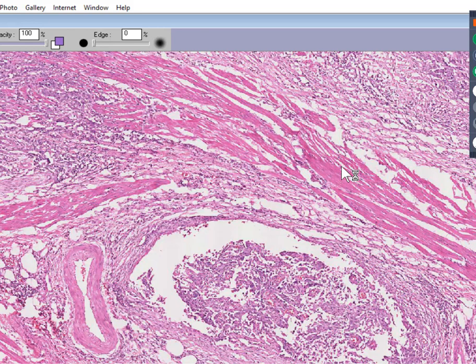So let me ask you this. If this was the bladder, which it is, and this is also a transitional cell carcinoma of the bladder, although it's not as papillary as the other one that we saw. If this was a bladder, and we could see that the tumor invades into the bladder wall, do you think that possibly the surgeon might want to take out the bladder? Because if the tumor only involved the mucosa, he could maybe remove it by cystoscopy and then keep a close eye on the patient with multiple cystoscopies.